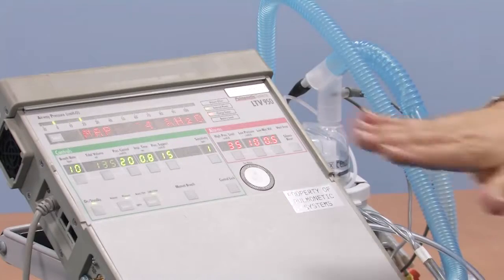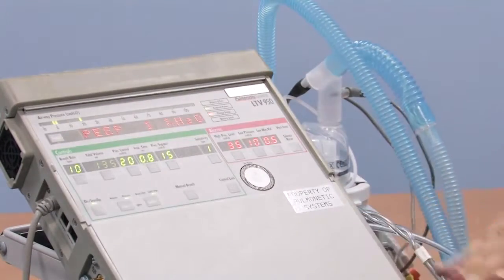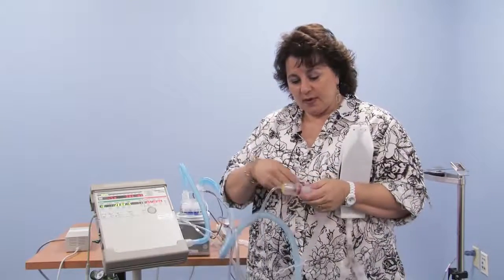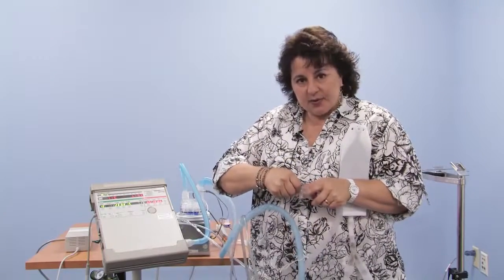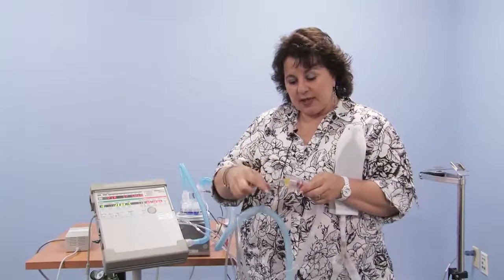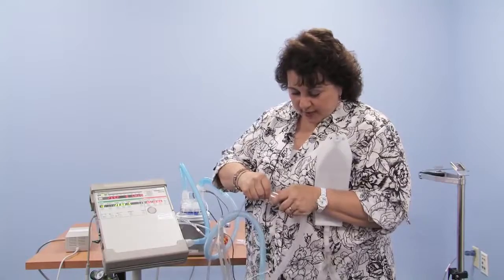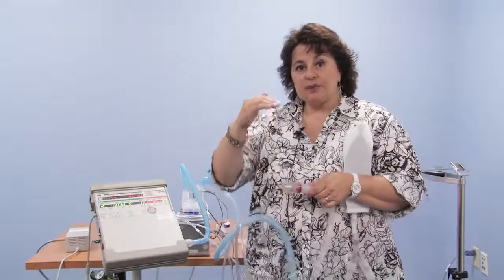So we need to set the PEEP, and there is no place to do that here. There's a place to see what it is, but there isn't a place to set it. On the LTV 950, remember we have the circuit that has the PEEP valve in the hose. So this says press to turn. If I press the yellow thing and turn it and look at the numbers, it turns very quietly. If I don't, I feel like I'm going to break it. So you do want to follow the package instructions and push on the yellow, not this, but the yellow, and dial down to approximately, we're going to say 5 for this child, 5 of end exhale pressure. So the ventilator inflates up to 20 of pressure and releases down to 5.